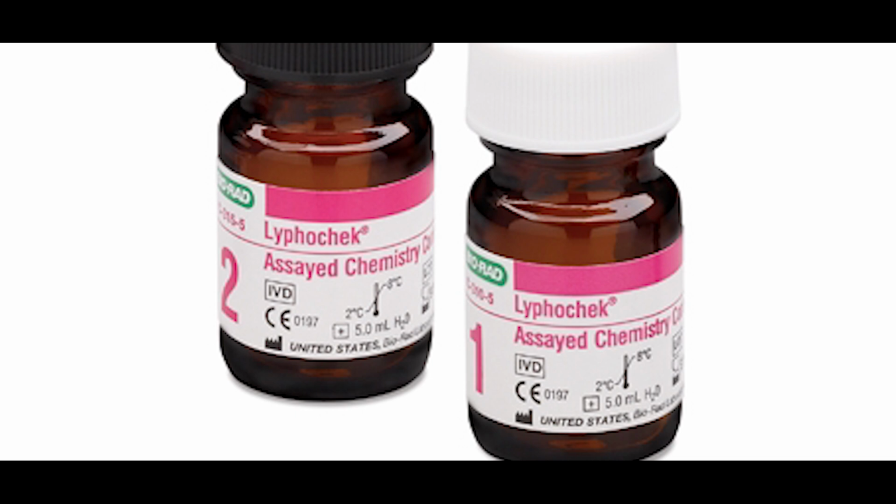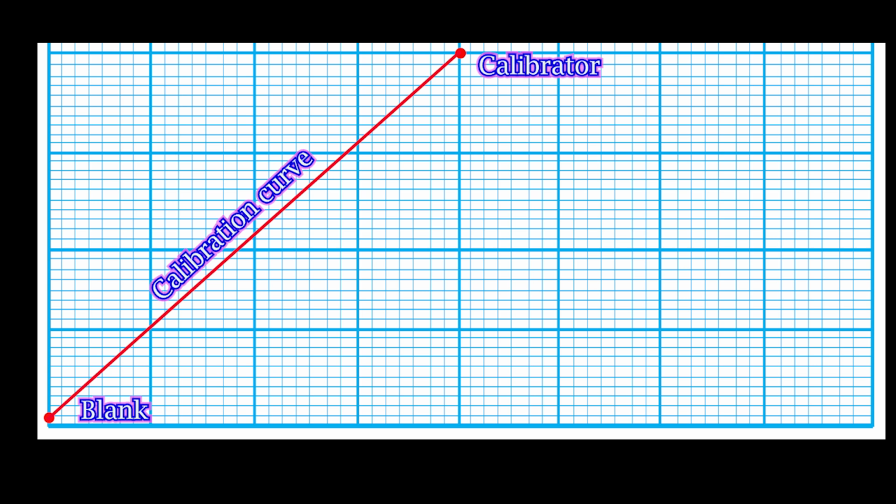Calibrators contain matrix material and mimic a patient sample. More than one analyte can be added and the same calibrator can be used for many analytes. Standard graphs are useful for initial assessment and establishing basic relationships. Calibrators give a more advanced and reliable approach for accurate and precise measurements in various analytical and measurement applications. Calibrators are more expensive compared to standard solutions.